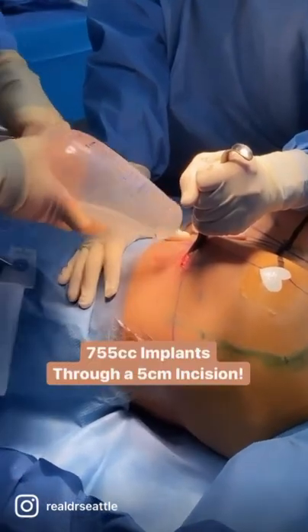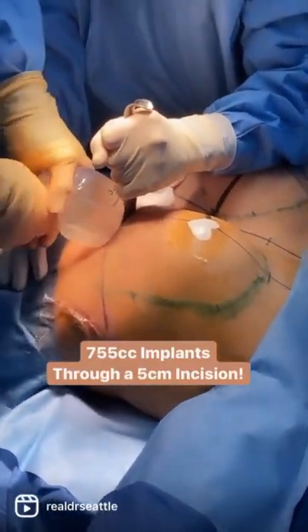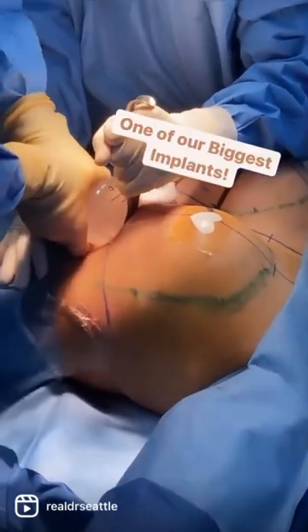You're going to see something no one else is going to show you — how to do a 755 in someone who's transgender. Gummy bear through a 5cm and 6.